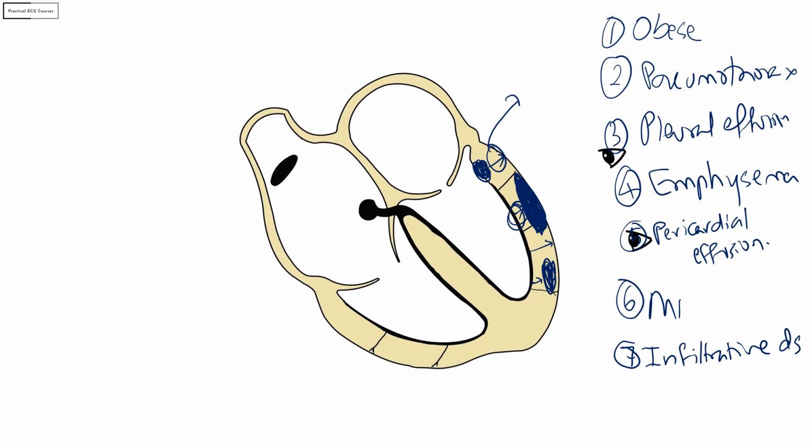Patients with some of the cardiomyopathies like dilated cardiomyopathy, DCM, can also have diffuse myocardial fibrosis. And again, smaller vectors and therefore lower voltages on ECGs. So to summarize, low voltages can be caused by many problems anywhere, either in the myocardium or outside the myocardium. Within the myocardium, it's usually because of the loss of viable myocardium, causing smaller vectors, like in MI, like in the infiltrative diseases like amyloidosis, sarcoidosis, hemochromatosis, myxedema, DCM. Essentially, the principle is the same.